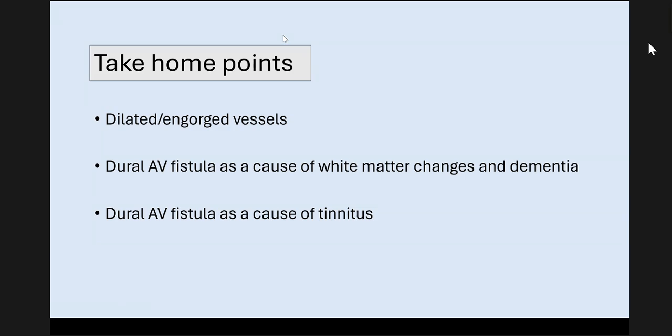Yeah, somebody has mentioned dural AV fistula, fantastic. Another patient, venous hypertension, brilliant. Why diffusion weighted changes? Was there true restriction? Very good question. I don't think there was any true restriction.